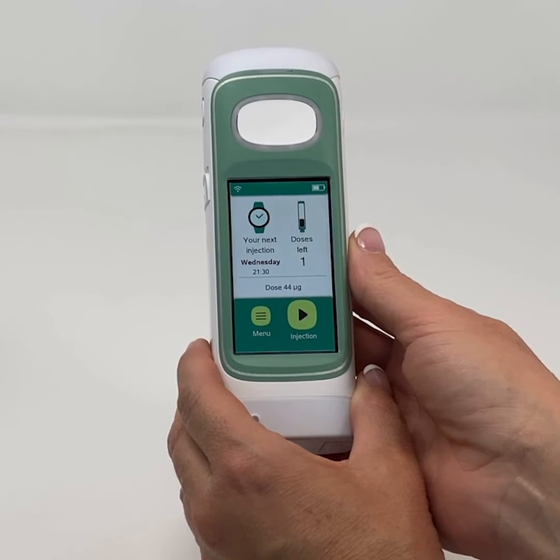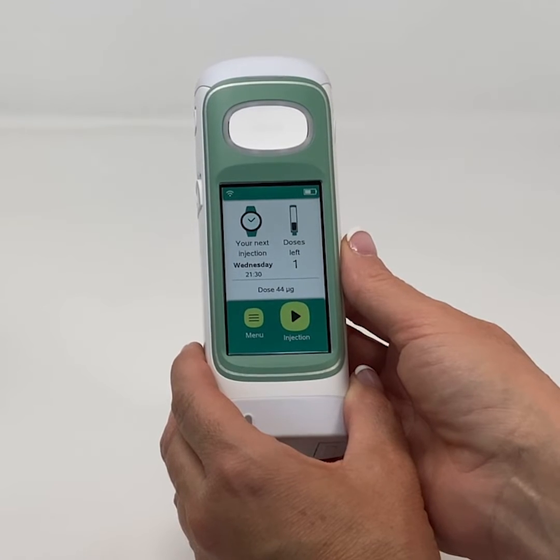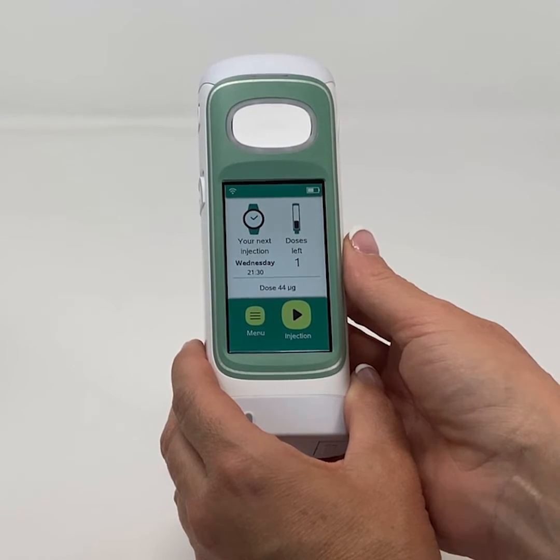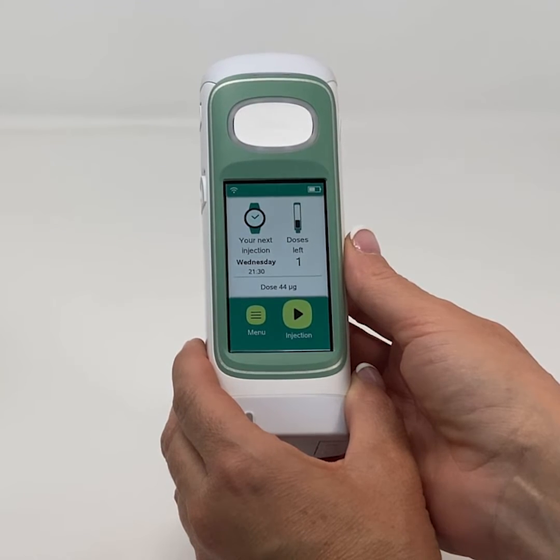The device facilitates the administration of the drug, including self-administration by patients at home. In addition, adjustable comfort settings including the way the device performs the injections is available. Patients should receive training by a doctor or nurse before they can use the device.